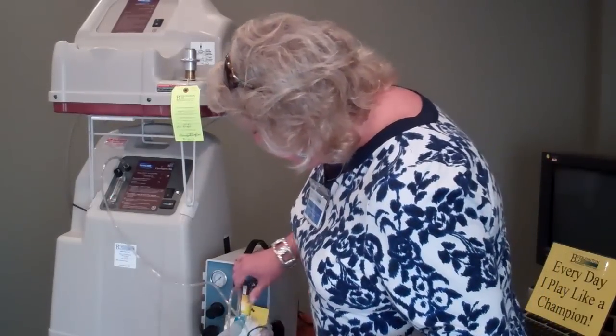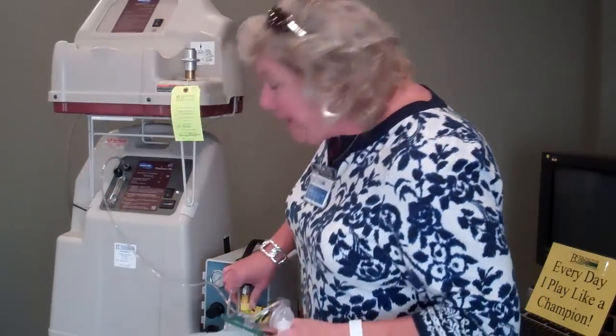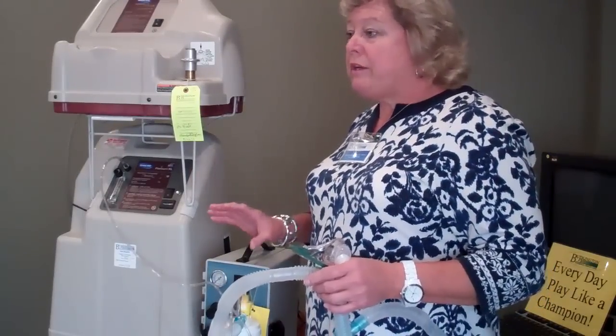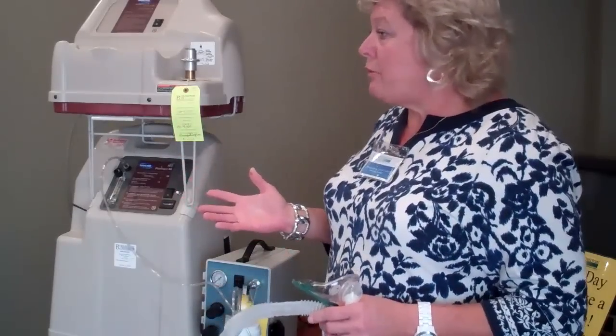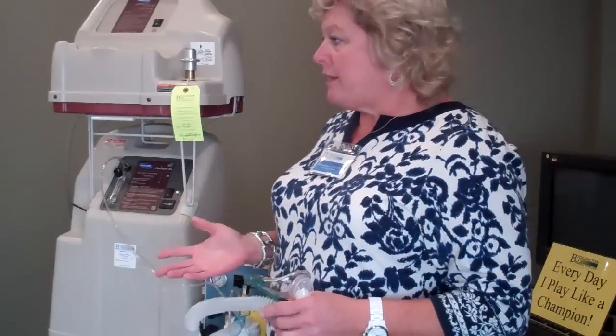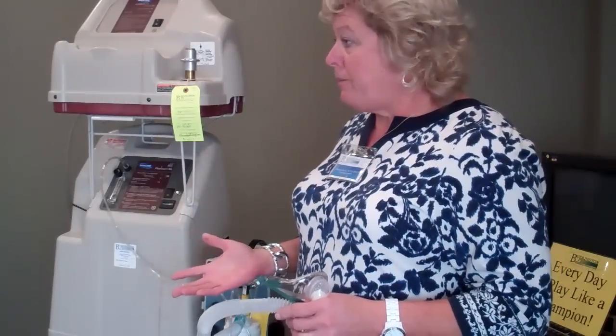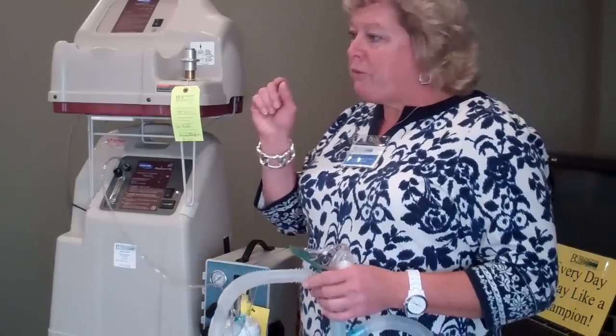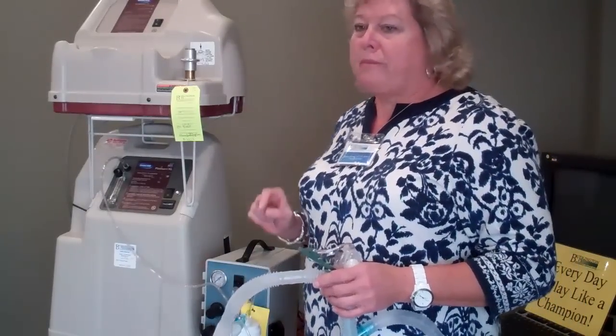With the 50 PSI, you're going to set the dial on about 70 — that's usually pretty typical, and it makes it a little quieter. When it's opened all the way to 23–24%, it makes a lot more noise because it entrains a lot of room air. We want to dilute some of that room air out, so we close the dial off to 70, which puts in just a little bit of room air.